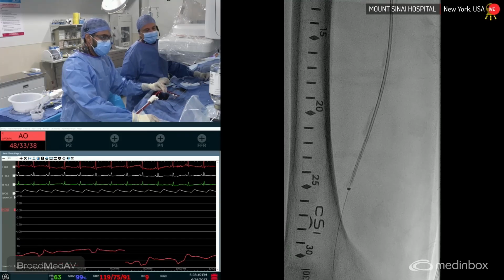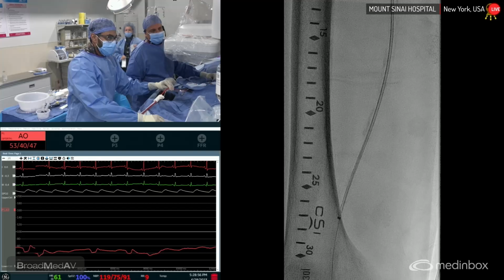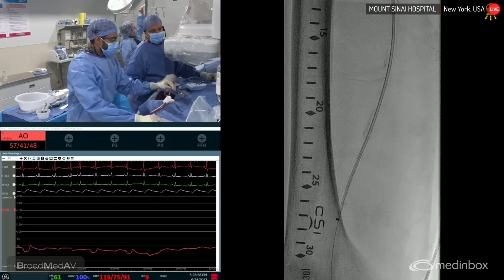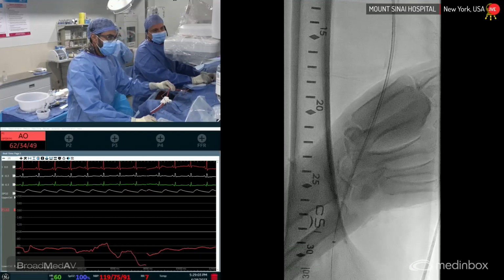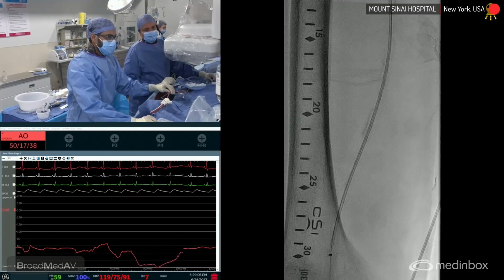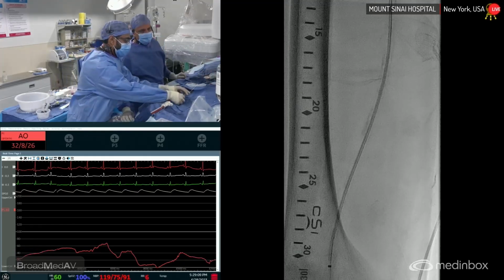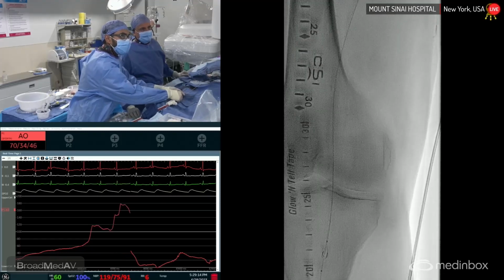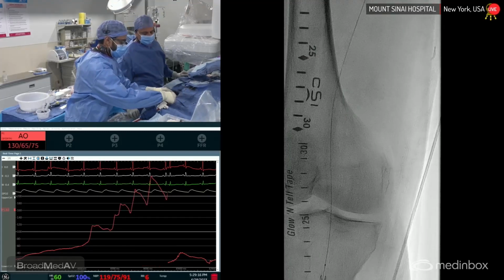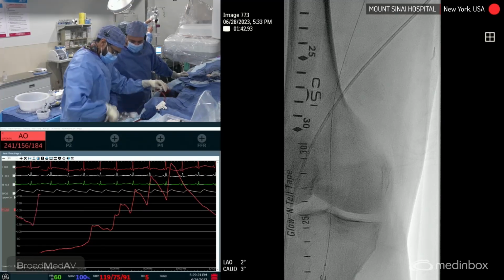And remember, we said it was by the C of the CSI that the occlusion really starts. And you can see very, very soft plaque with overlying thrombus, which may or may not be able to work here. And we're able to pop through it. Okay, now I'm going to let Dr. Ali just walk it back. Leave it on? Yep, you can just walk it back with it on.